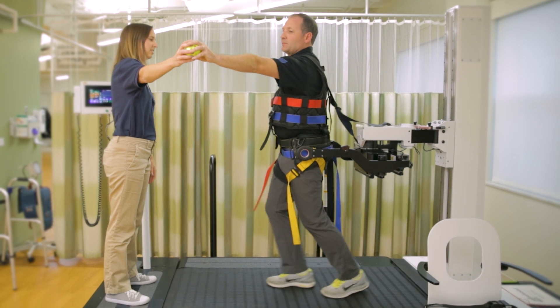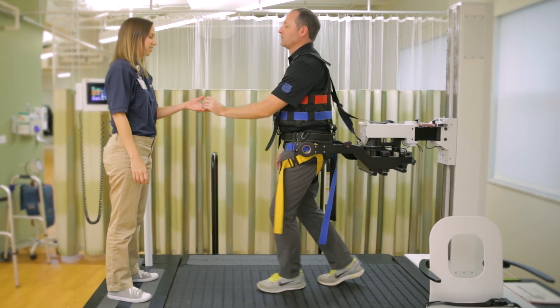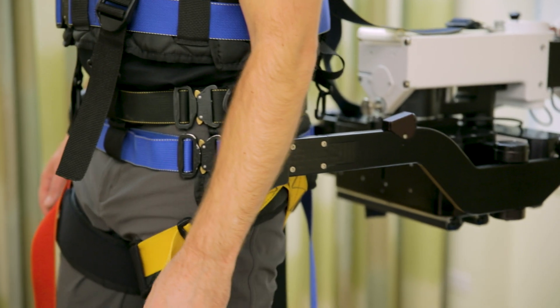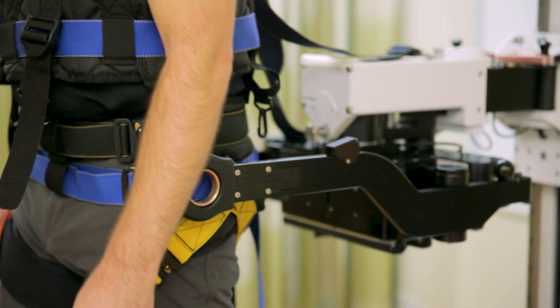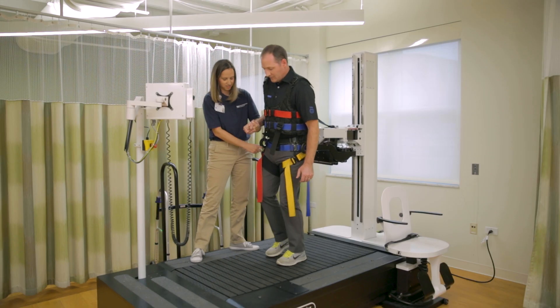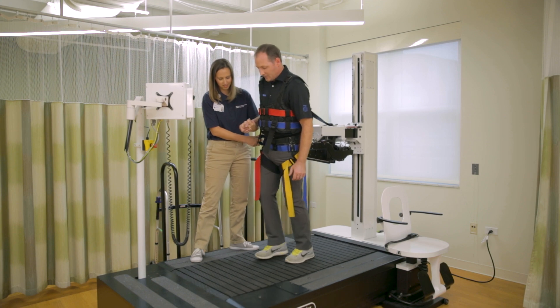The training intensity can be increased as you master each level. If you have neurological, cardiovascular, or orthopedic impairments, including joint replacements and amputations, or general age-related reconditioning, you may benefit from using the KineAssist MX.